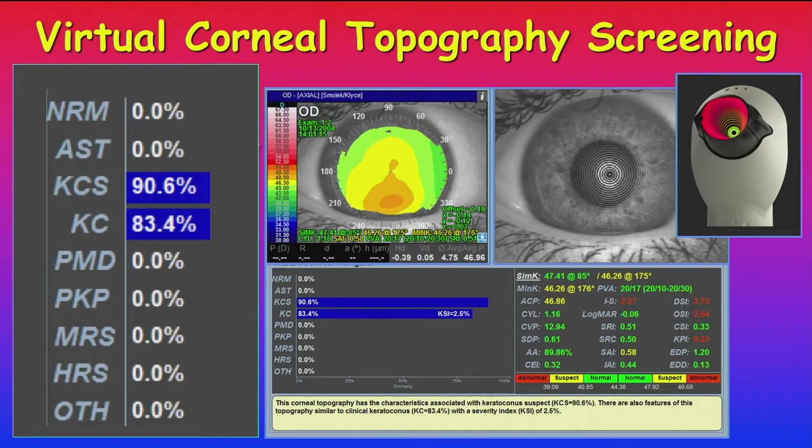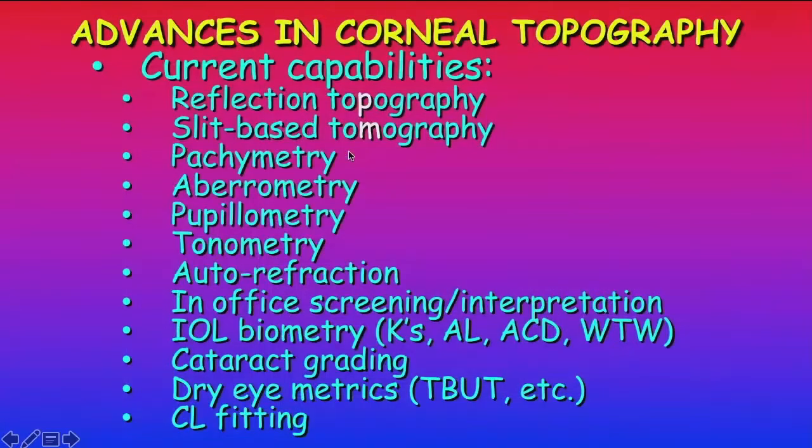And unless you train these systems on all of these different types of presentations, how can you say that any of these screening devices are specific? They're not specific in the clinic. They might be very specific when you train them only on two classes of cornea. So that's a very important point that I'd like to bring out.